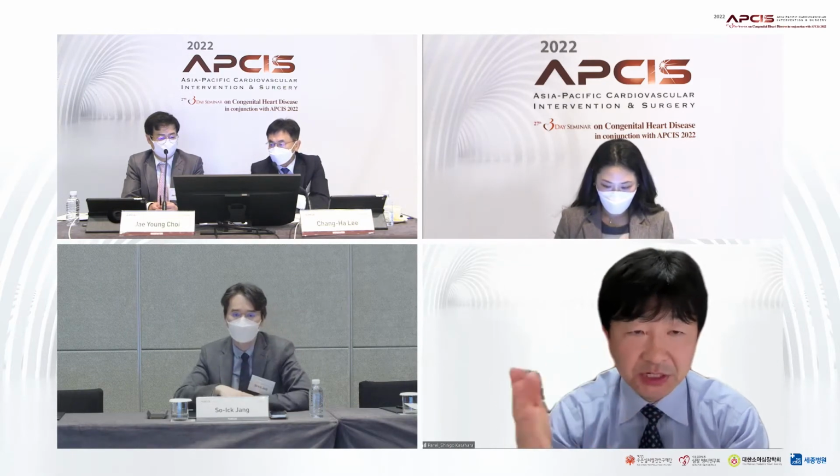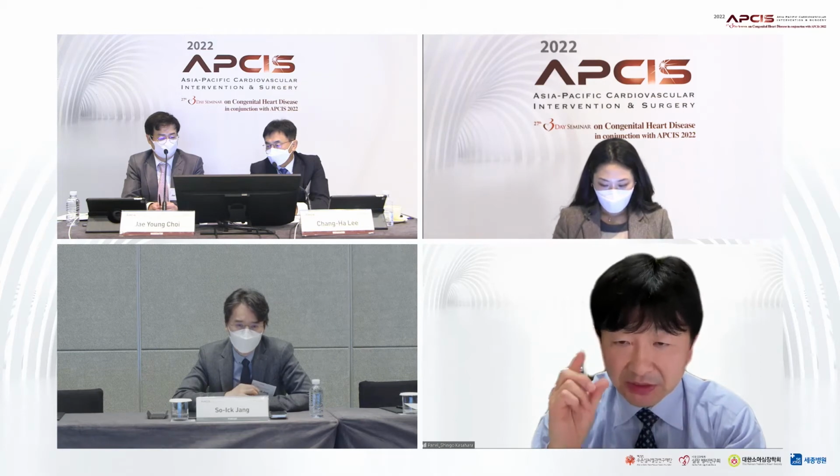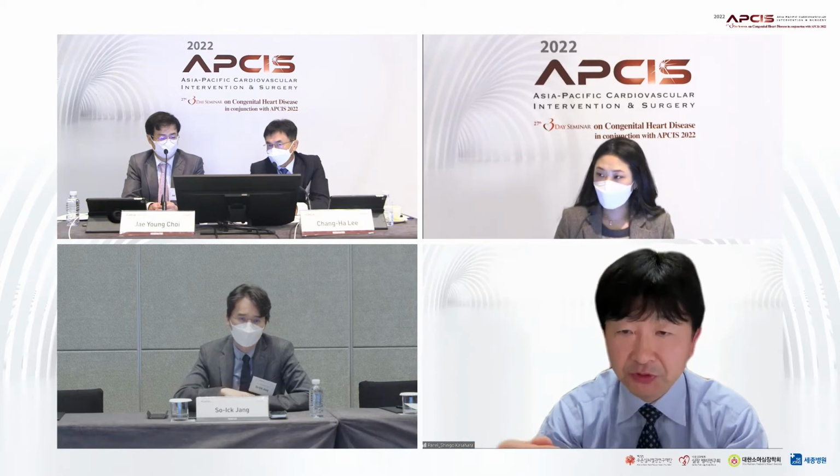But in the surgical view, that narrow segment is due to angulation. I think that is related to the surgical technique. Maybe at that time we fixed the angulation of the LPA completely.